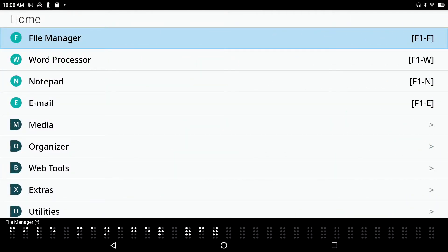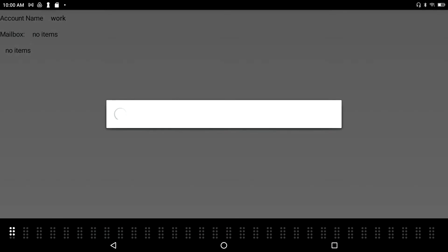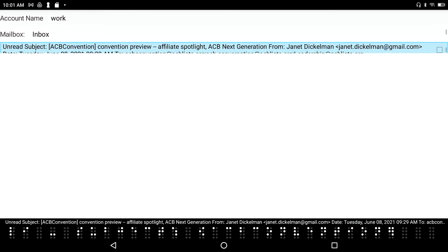Setting up and using email. The BrailleSense email client can be accessed from the main menu. I press F1 to go to the file manager, and I know that the shortcut key to launch the email application from the main menu is the letter E. I do have one account set up — it is my work account — and I can see I've got something regarding the ACB convention.